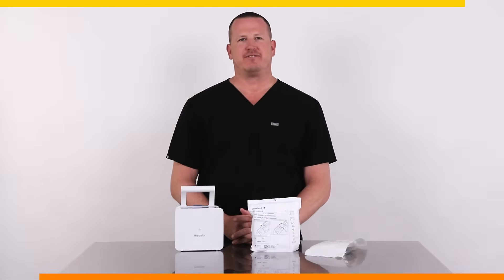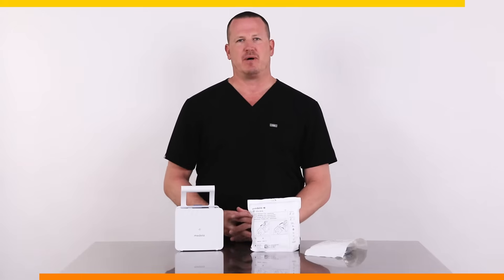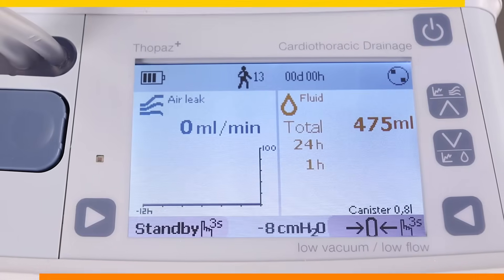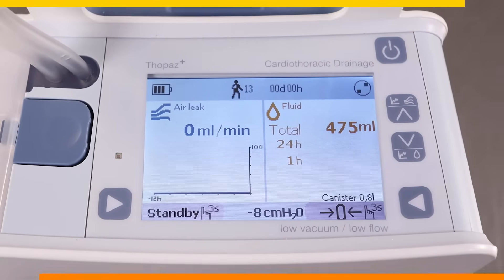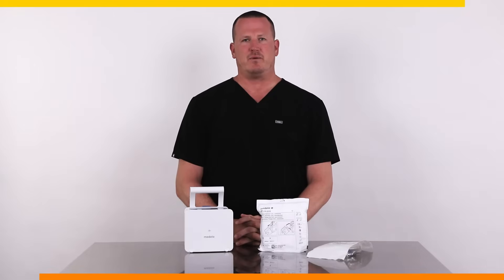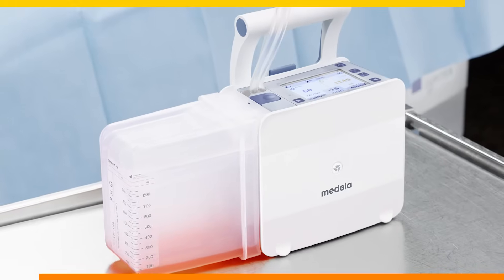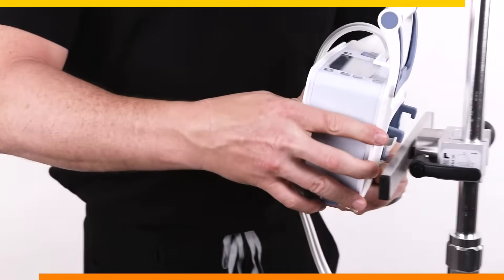This system is unique and quite different from any analog system that you have been using. There is no need to add any water and you will not see or hear any bubbles from the system. All of the therapy information will be available digitally on the device screen. The Topaz Plus can be placed anywhere and it does not need to be below the level of the patient's chest. It can be mounted on the patient's bed, placed on a bedside table, or mounted on an IV pole.